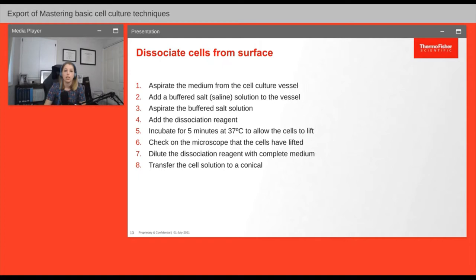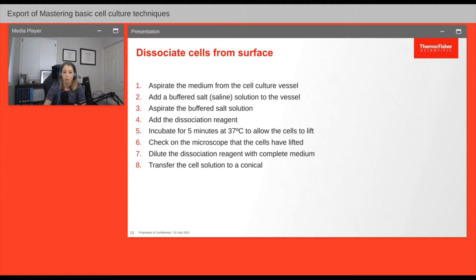After the incubation period, check the cells on the microscope to make sure they are all free-floating. If they are, quickly add fresh culture medium to dilute the dissociation reagent. Finally, move the cells to a conical tube and continue with the rest of the subculturing workflow.